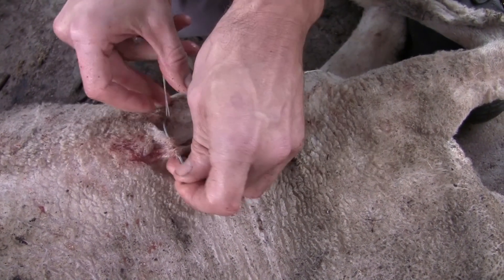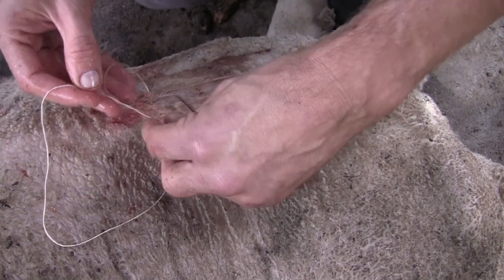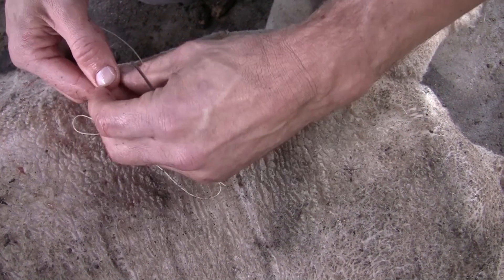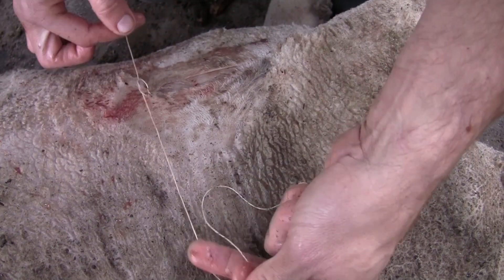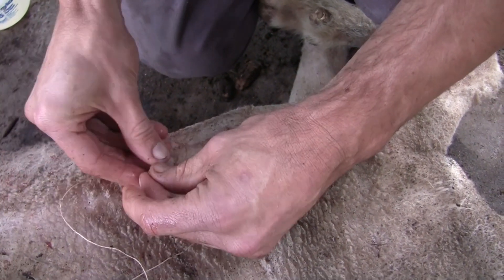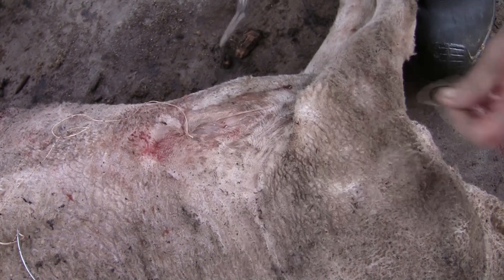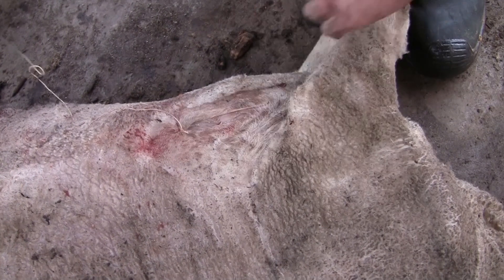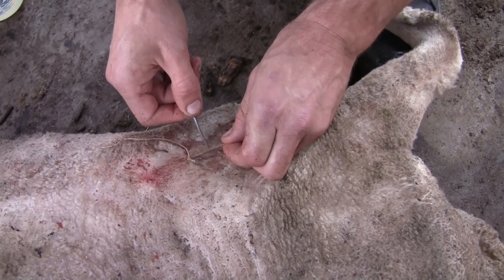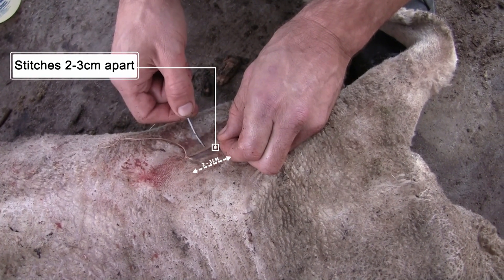Place through the first layer of skin and the second layer of skin, and we're going to bring the two edges together. Then simply do a single throw, bring it together, then do another throw, bring it together, and finally a third throw and bring it together. That area is now tight, so we're going to cut that last section of cotton material and continue the suturing method. The important factor is not to go too wide — if you go too wide it will lose the strength of the suture itself and you're more likely to get wound breakdown.